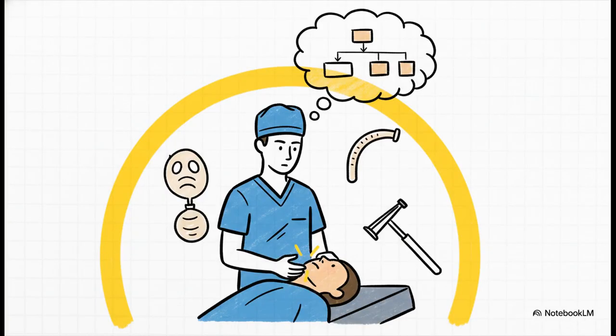And this is maybe the ultimate safety rule in all of anesthesia, and it applies here more than ever. You must always plan for failure. Assume at any moment the technique could stop working. That means before you even start, you have your backup plan ready to go, your face masks, your LMAs, your intubation kit, all checked, all right there within arm's reach.